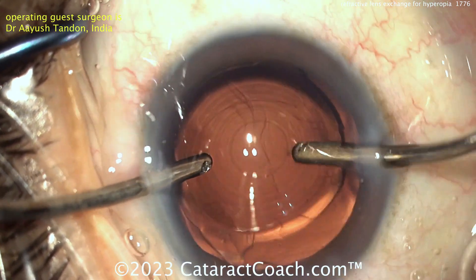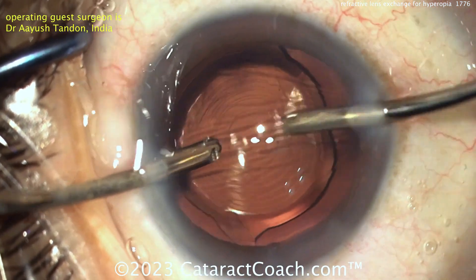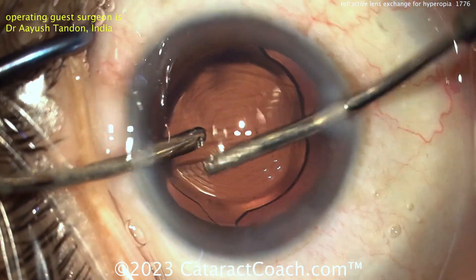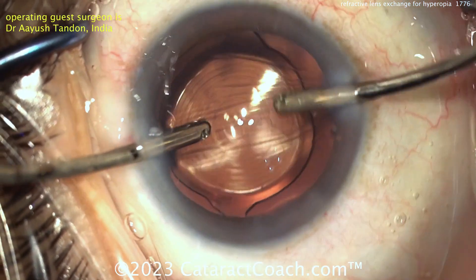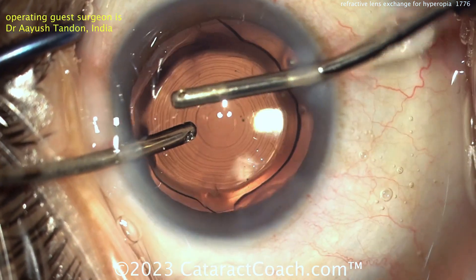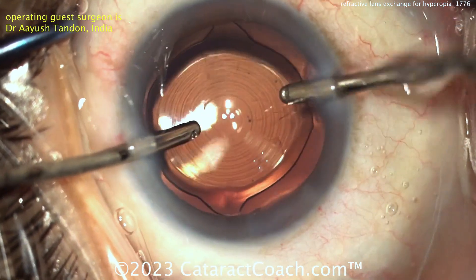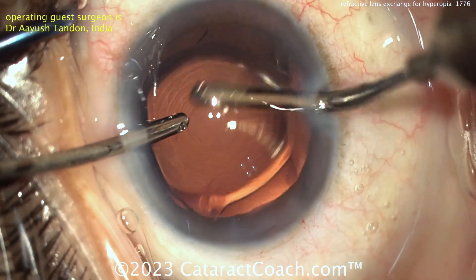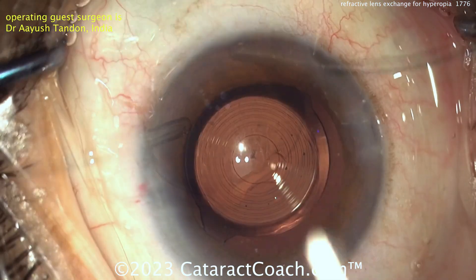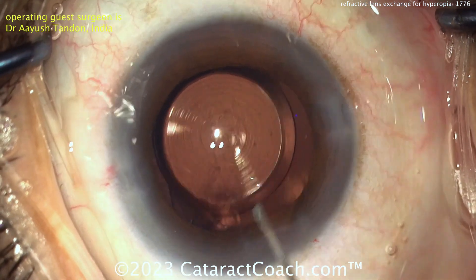Taking out all the viscoelastic now. We've talked about lining up that IOL with the appropriate axis, and we talked about angle kappa and angle alpha, the visual axis, and the pupillary axis. A nice easy way is to get those Purkinje images lined up, both in that very central zone of that optic — that'll give you pretty darn good performance for most patients who have reasonable angle alpha and angle kappa. Here at the end of the case, get that viscoelastic out of the eye.